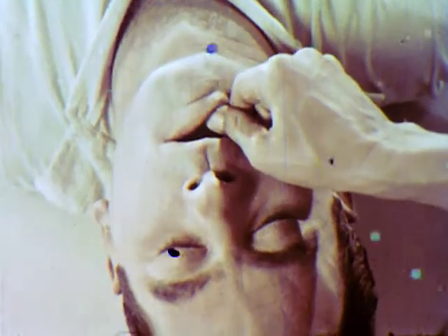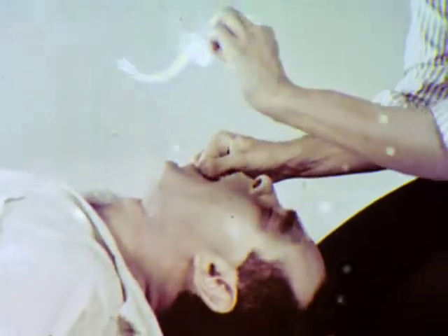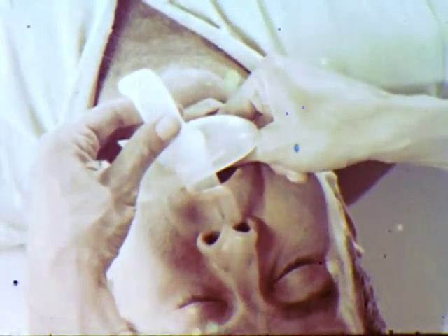Place him on his back, face up, tilt his head backward as far as you can. If you feel no breathing through mouth or nose, force his mouth open with your thumb and index finger crossed. If you have difficulty forcing the mouth open, insert your index finger between cheek and teeth and wedge it between the jaws behind the back teeth. Hold the resuscit tube so that your mouthpiece curves back toward you. Insert the other end over the tongue. Do not push the tongue back into the throat. If necessary, hold the tongue forward with your finger during insertion.